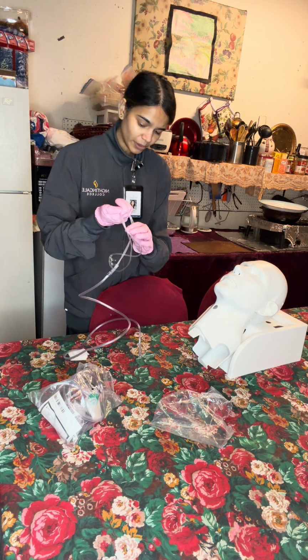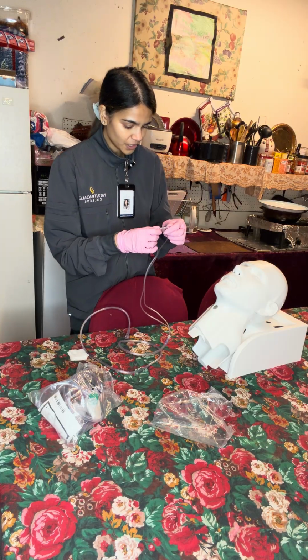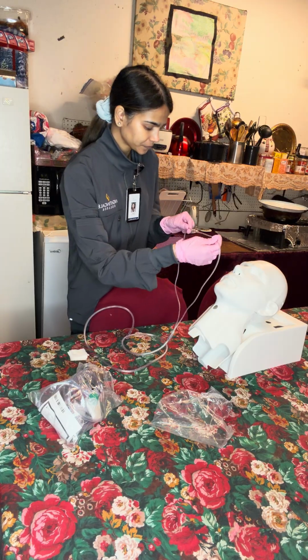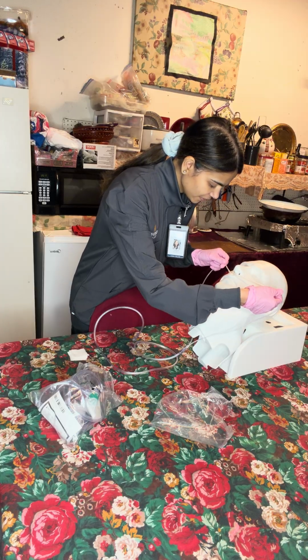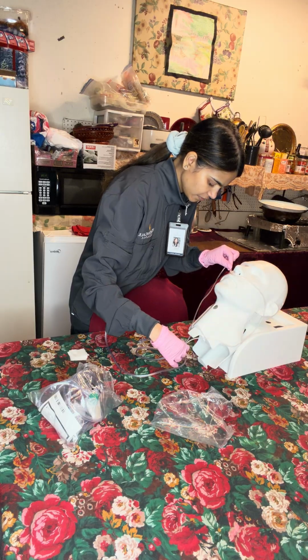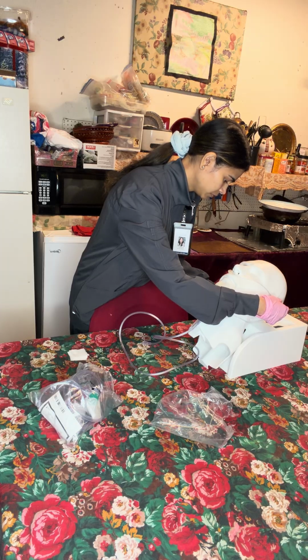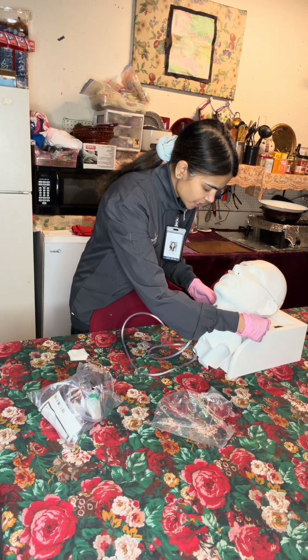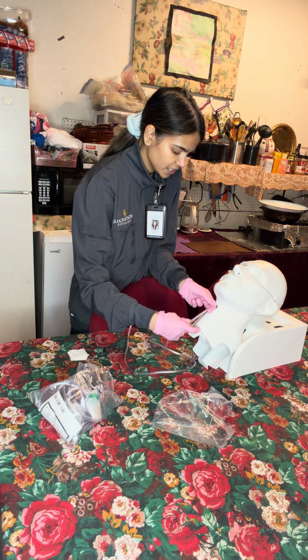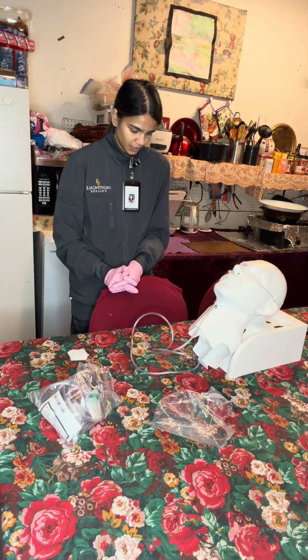And then I will apply the nasal cannula to the patient. I will let them know that this device will go into the nares of the nose and that oxygen will be administered through the nose. I'll carefully place the device into the nares and loop it on the ears of the patient. Once the nasal cannula has been applied, I will adjust it accordingly to the patient so that it's secure and that an adequate and efficient amount of oxygen is administered.